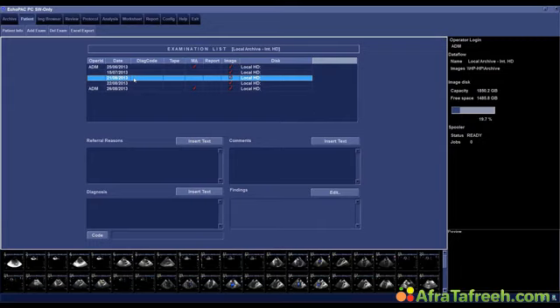Since he was coming back all the time with heart failure, we decided we'll do a special procedure with him, which is called the MitraClip procedure. I'm sure most of you have heard of it. It's a new type of treatment which avoids going into surgery and opening up the chest, because by an interventional approach, we can clip the anterior and the posterior leaflet simply together, and thereby close the coaptation defect to a certain degree.